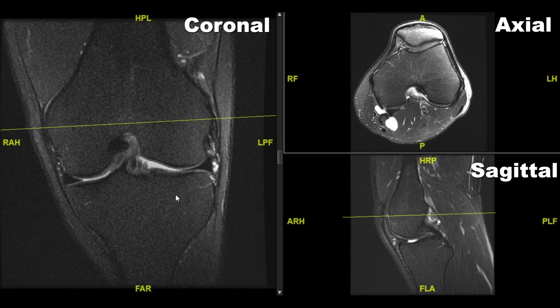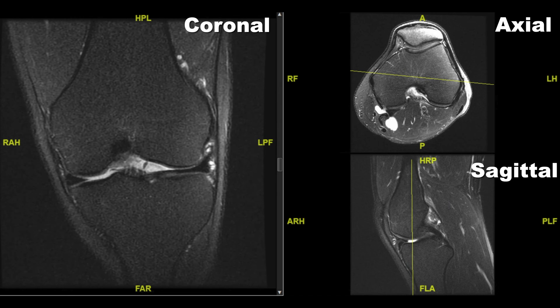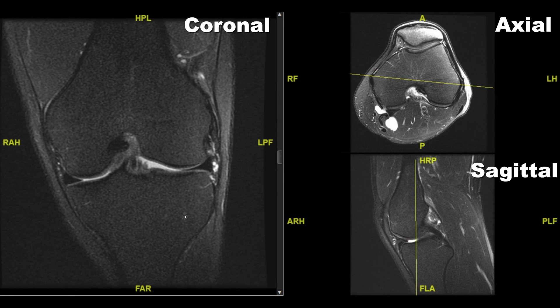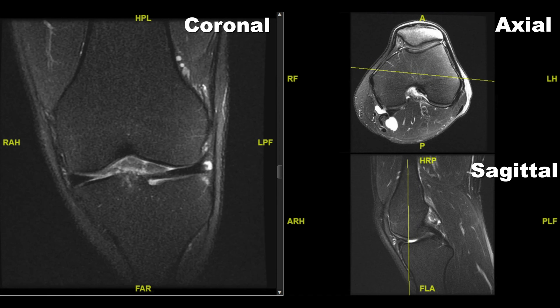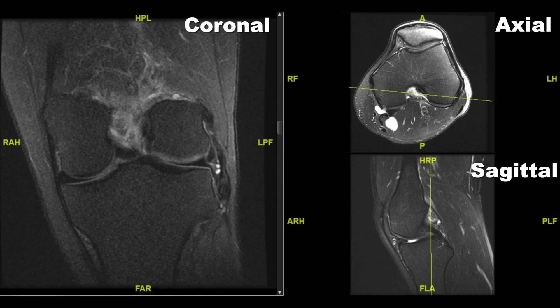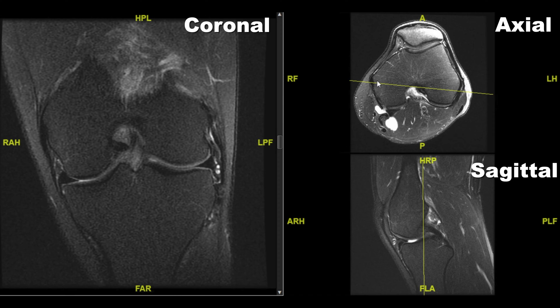Let's return back to this coronal over here, the big window on the left. As I start scrolling through this image, you'll notice these yellow lines moving through each one of the other images. These are called localizer lines, and they help us understand where we are in each image in reference to the other perspectives on the MRI scan.